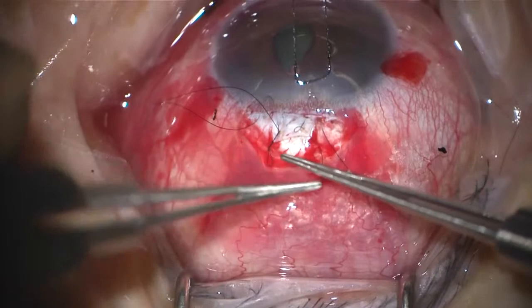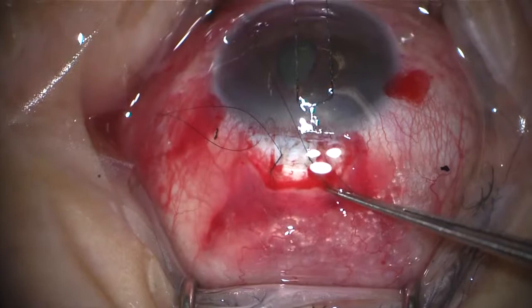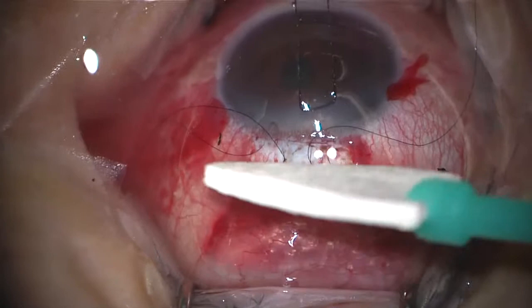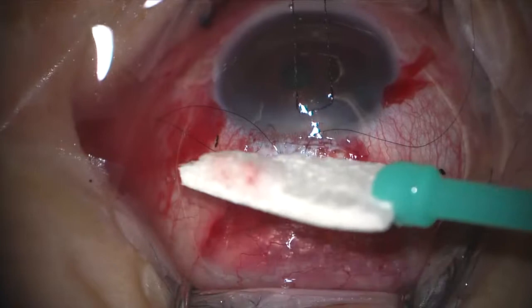So I'm just going to tie the other suture as well. So you can see the pupil's becoming back to its normal round shape now. There's no drainage there, but we just need to make sure there's no iris blocking it. Good, so the pupil's completely round now. And if we test the flap, it's completely dry, so there's no drainage there.